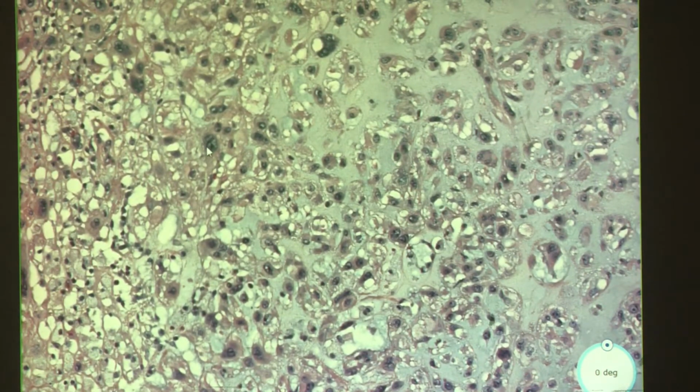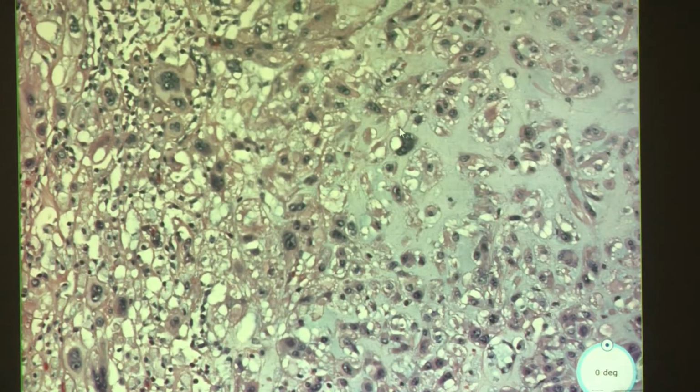This one's better. That looks like a definite nuclei. Maybe that's another nuclei. This one's also doing that, and maybe you can appreciate that these are somewhat hugging adjacent tumor cells. So it looks like we have a tumor cell here, and then we have this big one over here, and sometimes you can see that.